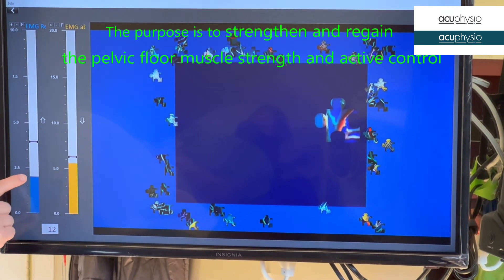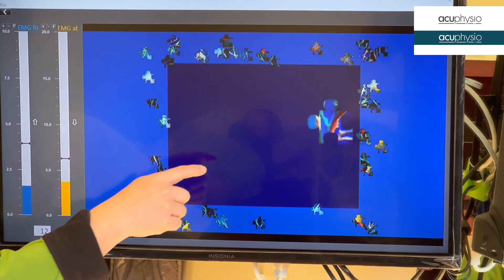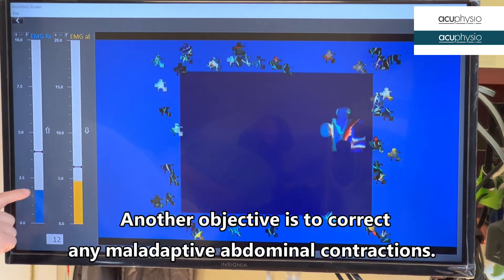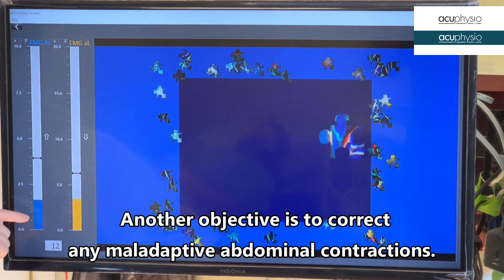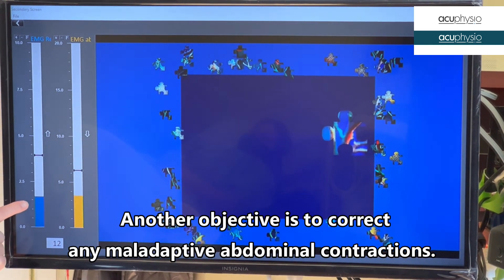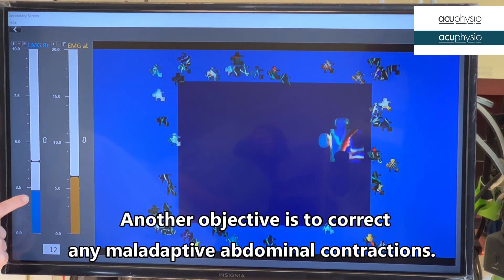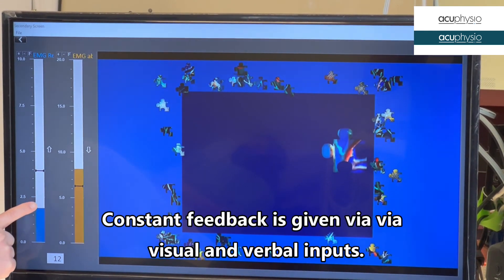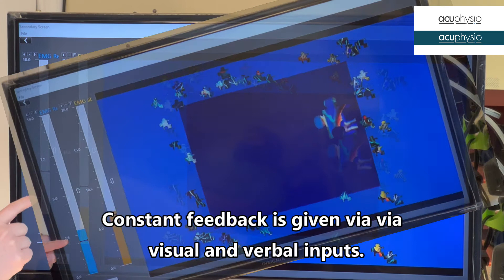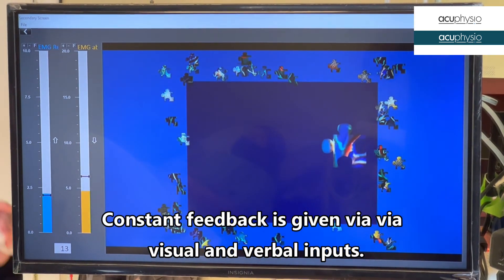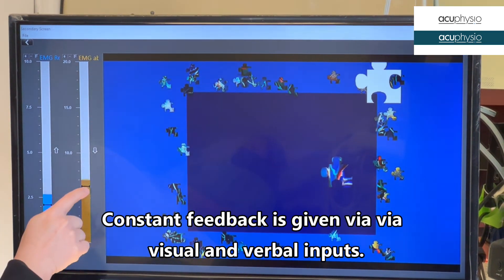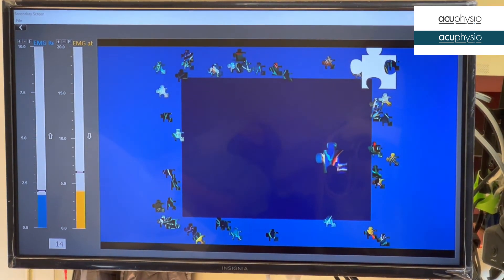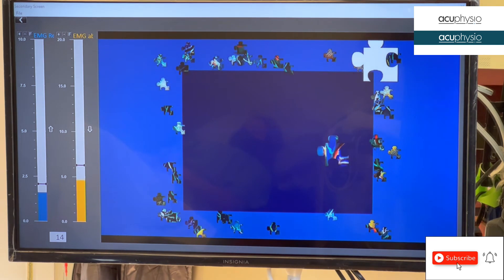Now, if you are able to do that, the puzzle is going to complete — it's going to move. If you cannot do that, I'm going to lower the bar down a little bit. Contract. Relax. I'm going to lower the bar down a little bit. Hold it there. Now you've got to relax your abdominal muscle. You have to relax your abdominal muscle, otherwise the puzzle is not going to move.